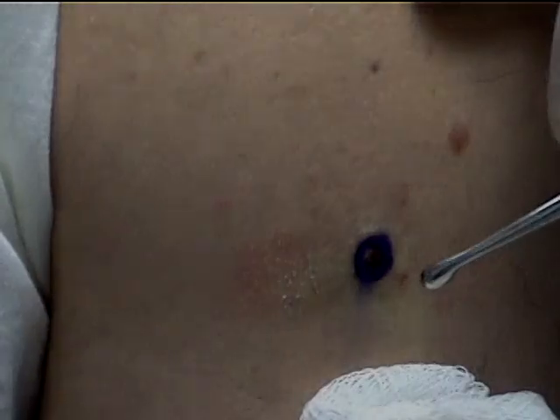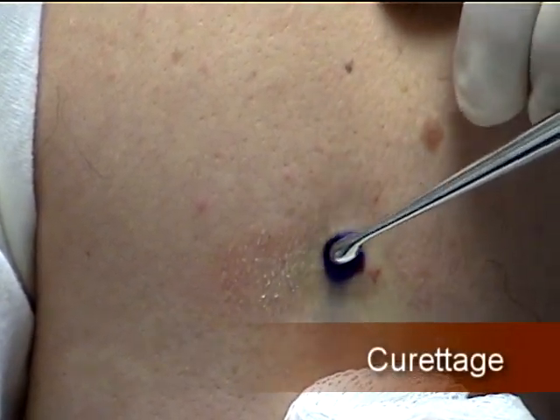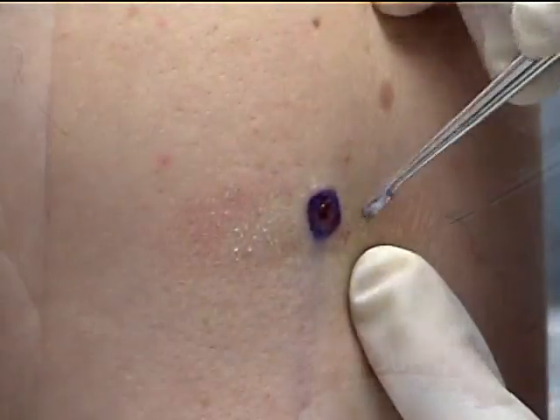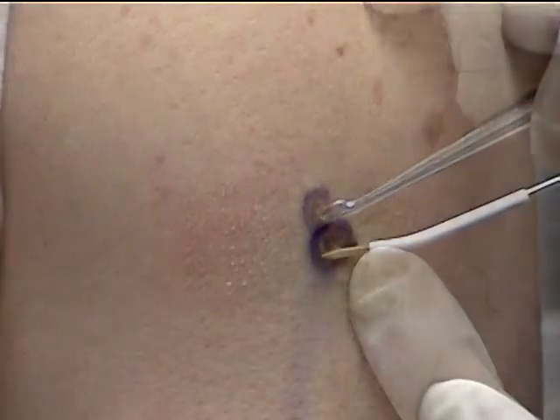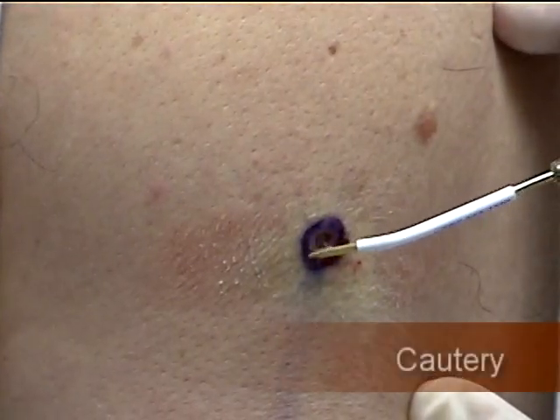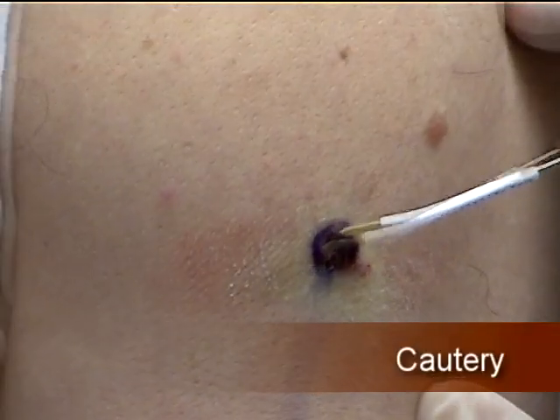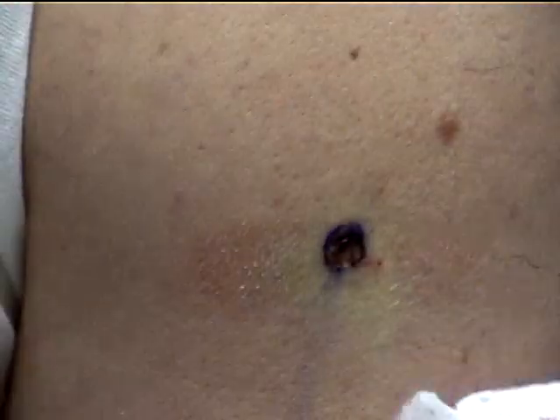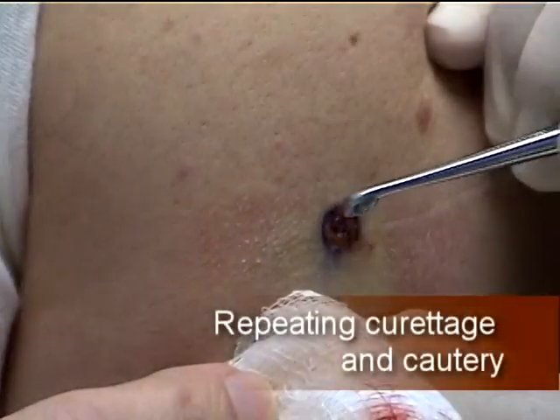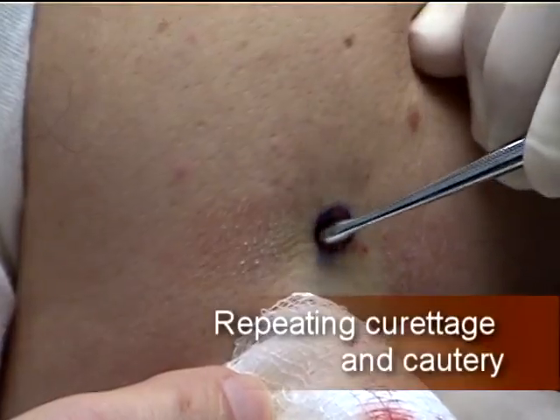Use a curette to scrape the lesion from the skin surface down into the dermal layer. As curettage is performed, the operator should be able to sense the softness of the basal cell cancer in contrast to the normal dermal layer. Remove all areas of abnormal density tissue. Be especially attentive to the area where the punch biopsy was performed and the prior borders from the surgical marker.